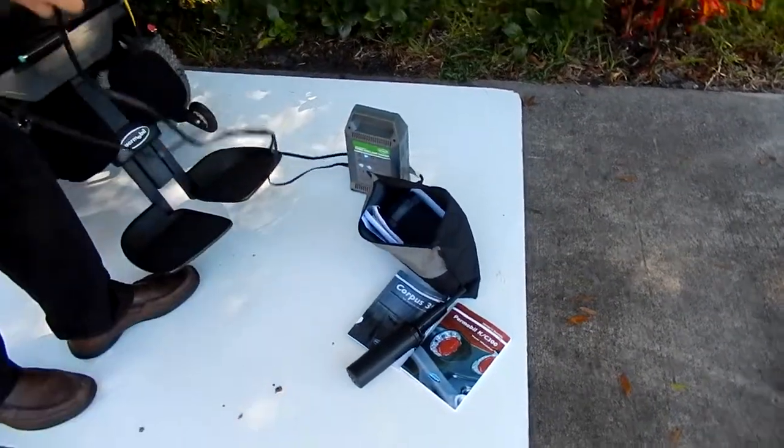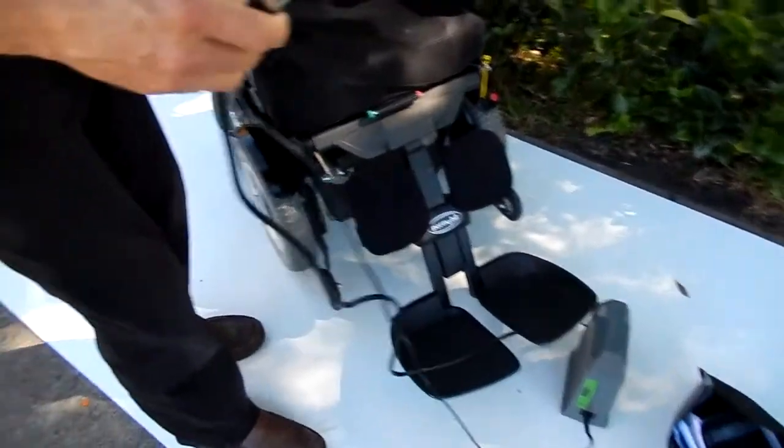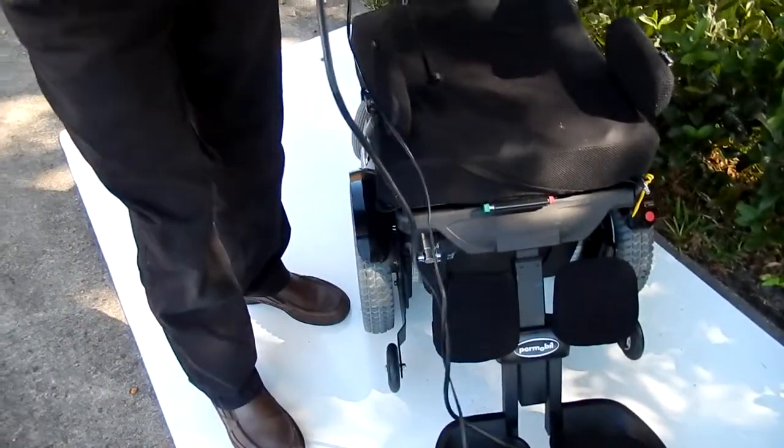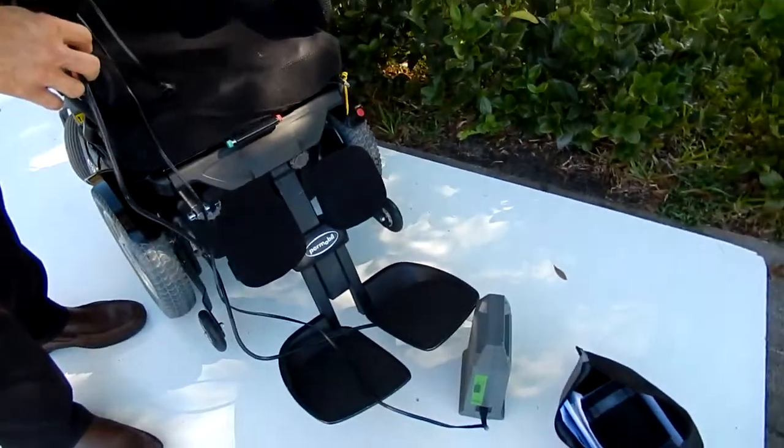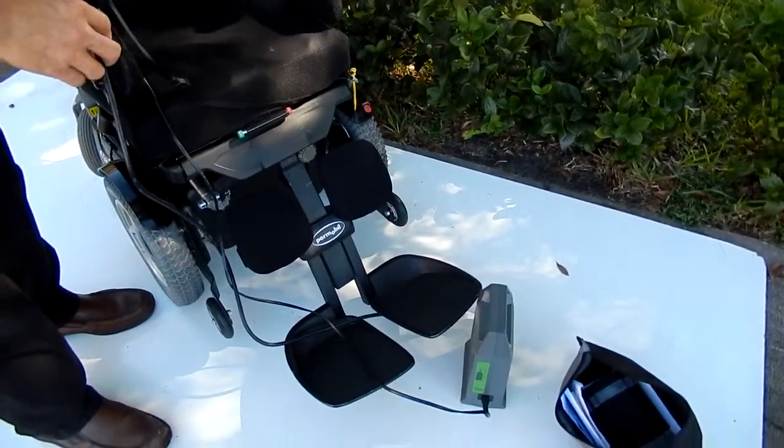The charger is here. If you need to charge this chair, the only thing you have to do is put your charger right over here. Once the light on the charger turns green, you're fully charged and you're ready to go for another day.